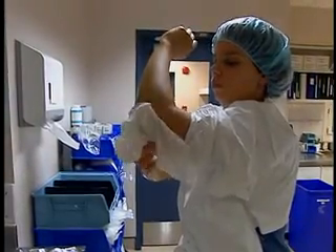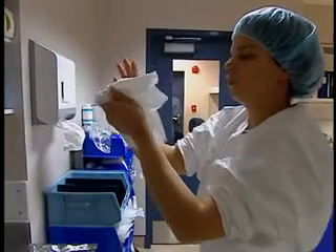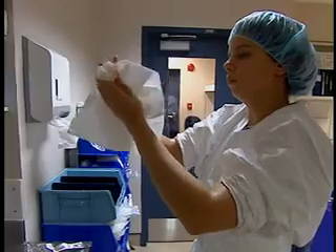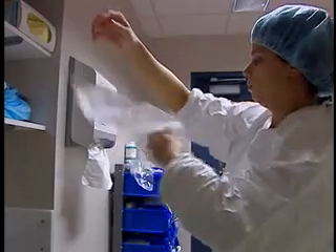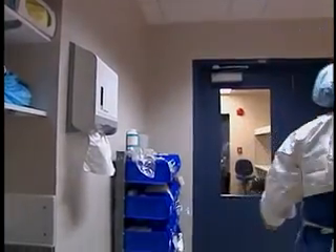Use a different towel for each arm and discard it without contaminating yourself. Lower the cuffs of your gown and close the tap with a clean paper towel, taking care not to contaminate your hands. Discard the paper towel. At this point you must not touch any part of your body or any contaminated objects.